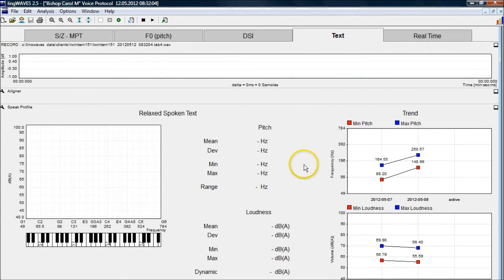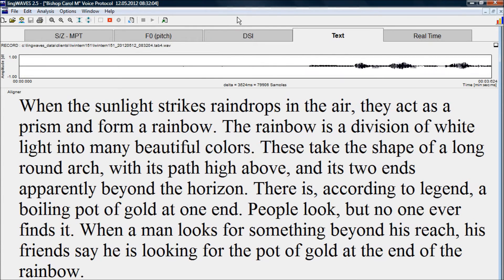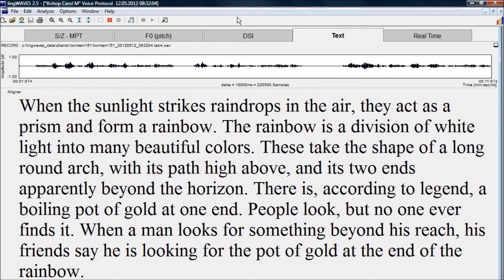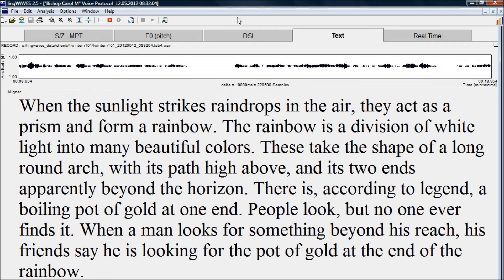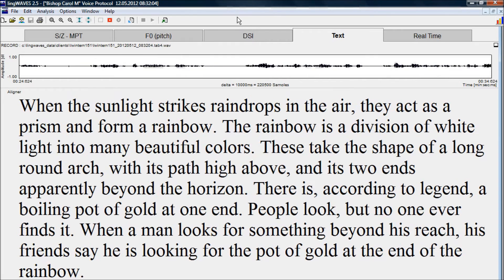The next screen is the text screen, where we record the client while they read the rainbow passage, and it shows us the voice range. Using the record button, the rainbow passage is displayed. 'When the sunlight strikes raindrops in the air, they act as a prism and form a rainbow. The rainbow is a division of white light into many beautiful colours. These take the shape of a long round arch, with its path high above, and its two ends apparently beyond the horizon. There is, according to legend, a boiling pot of gold at one end. People look, but no one ever finds it. When a man looks for something beyond his reach, his friends say he is looking for the pot of gold at the end of the rainbow.'